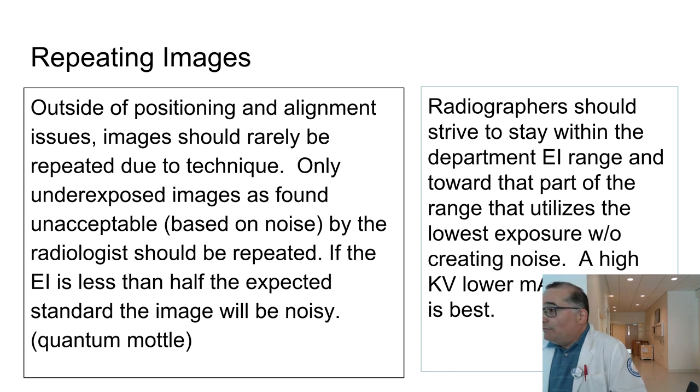Right, the whole selling point of digital radiography, at least one of the main selling points, was that you could lower the radiation to people, which is why things became a little bit devious when the manufacturers went out there and installed these units, and administrators would say, so what happens to our techniques? Do we need to change our kV? Do we use a certain percentage of mAs that's different than before? A lot of them would just say, no, you don't. Whatever you have works, because they knew that the consoles were already set up for film screen and that those techniques are higher than you need to use in digital imaging. So no need to adjust your APRs, your pre-programmed techniques.